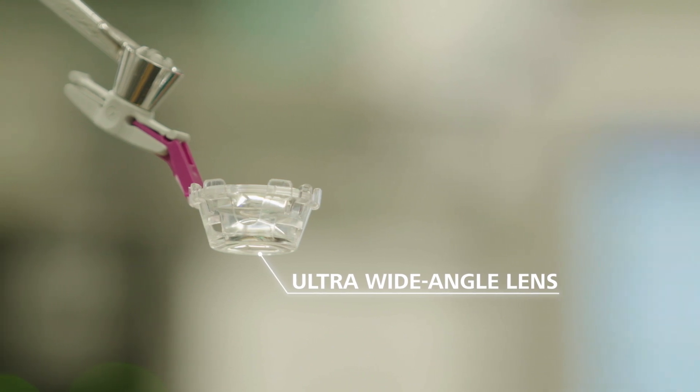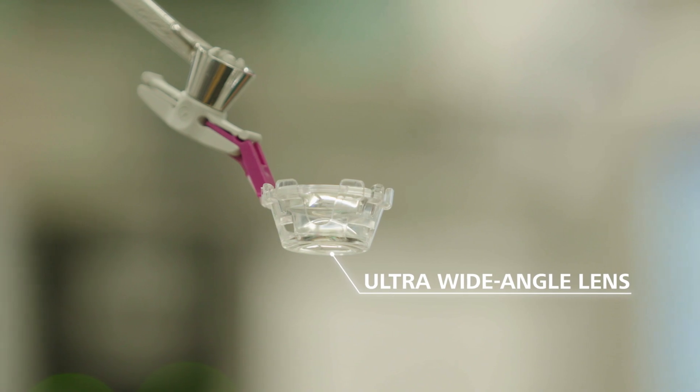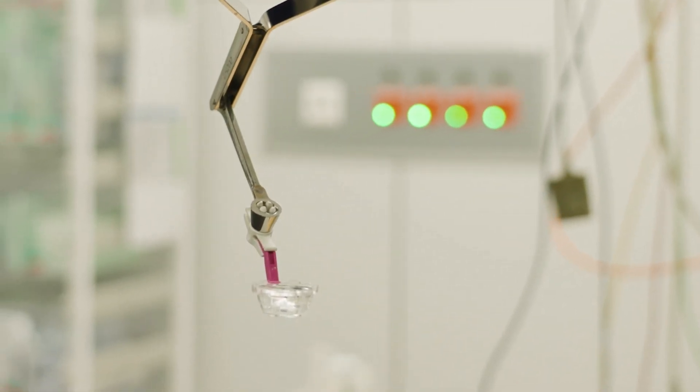The real killer lens, as I call it, is the new purple ultrawide lens. That's a new lens which has been built by putting two lenses on top of each other.